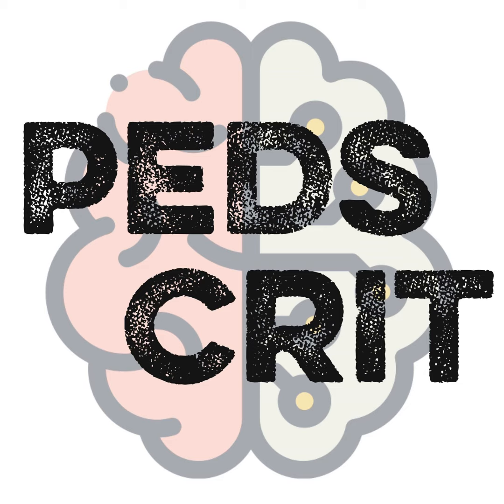In addition, even though your flows are fully captured, there is still blood that returns back into the left atrium. You have blood from the Thebesian veins, the bronchial veins, all of those also come back. And there is also some residual pulmonary blood flow. And all of this can start seeping into the lungs and then give you pulmonary venous hypertension and then significant pulmonary edema. This in turn can also increase your CVP, increases your RV afterload also. So in general, this can all culminate.